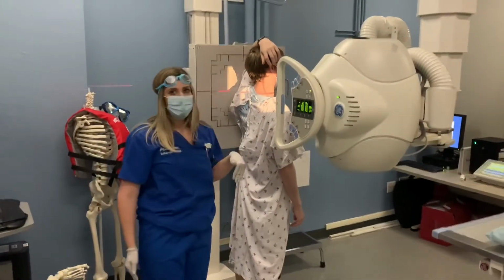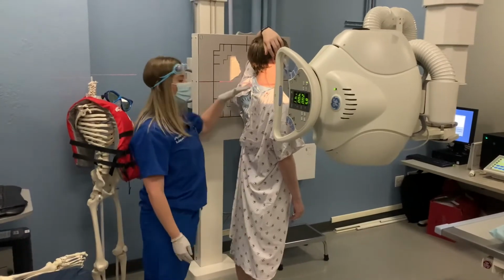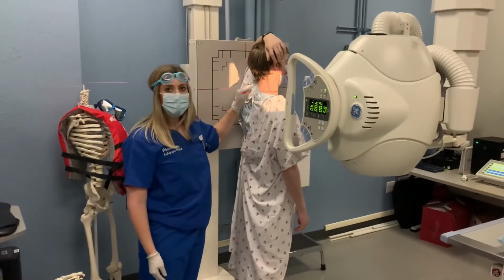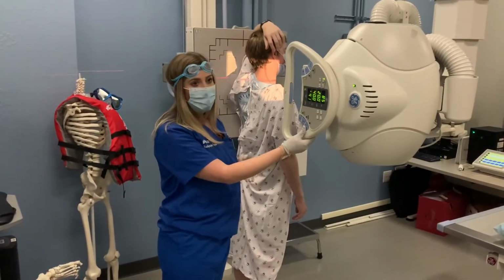Typically for this projection, we're going to be using a perpendicular central ray. However, if our patient is unable to depress their shoulder enough to clear that intervertebral joint space, we're going to add a 3 to 5 degree caudal angle.